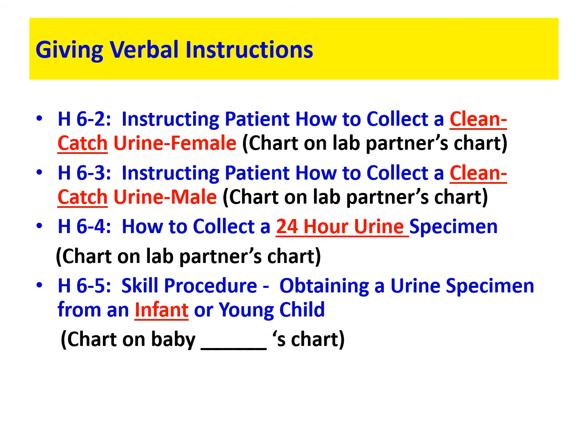So make sure, and you guys took home 3 soapy pads with yourself today after lab on Monday, and you all took home a sterile urine cup. Now, all the people in our class right now are female, so they're going to go home, sit comfortably on the toilet. Then you are going to take one of your soapy pads, open it up.